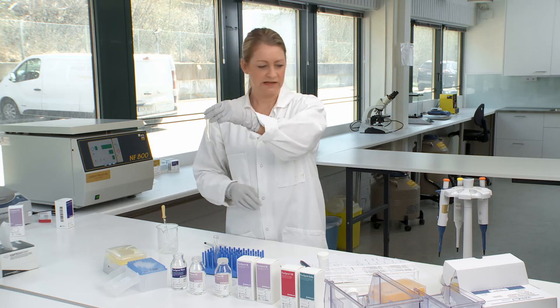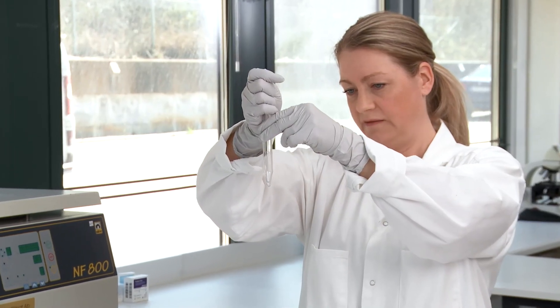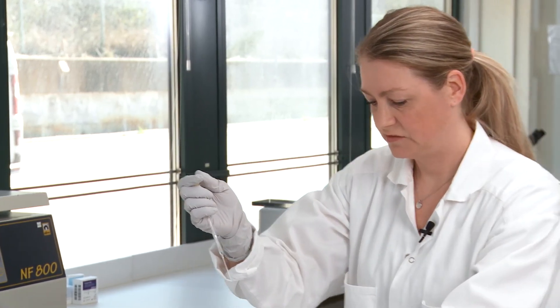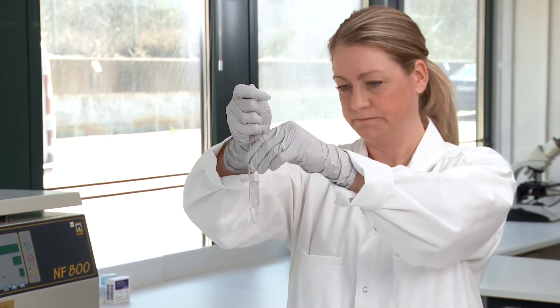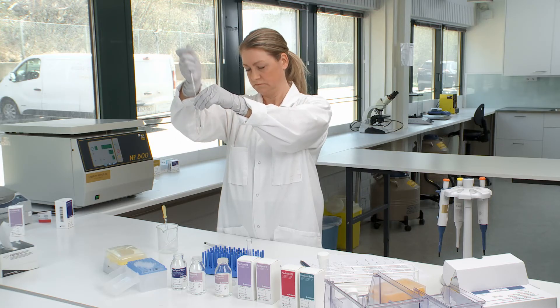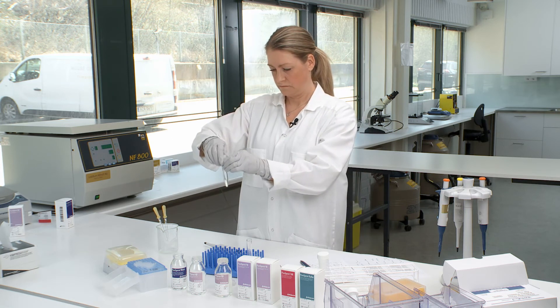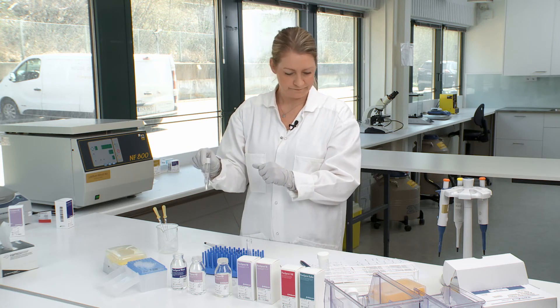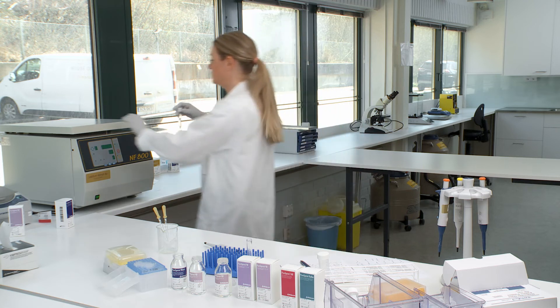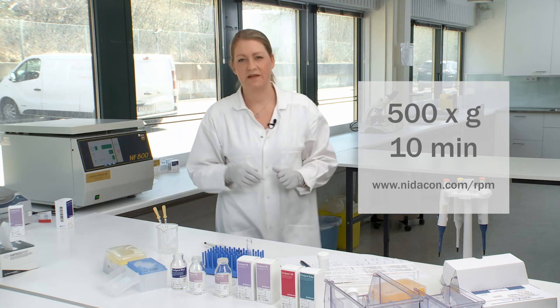Now take a clean pipette and pick up your pellet and re-suspend it into the washing medium. The washing medium is now ready to be centrifuged, this time at 500 g for 10 minutes.